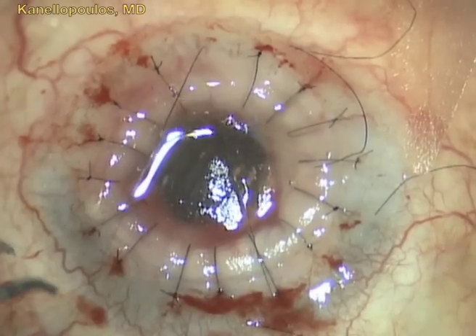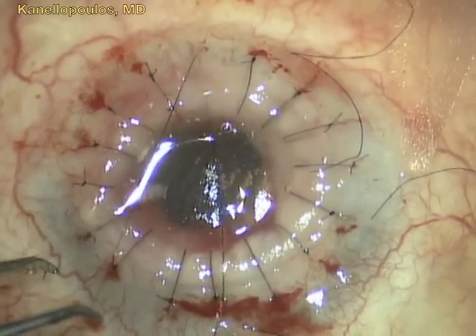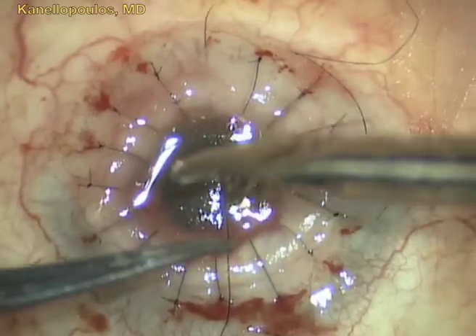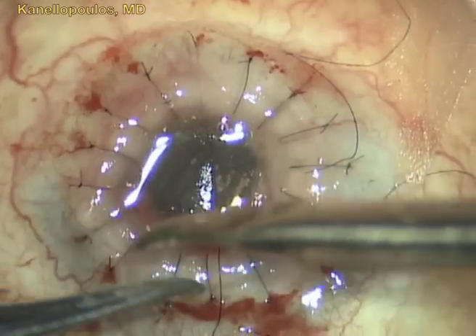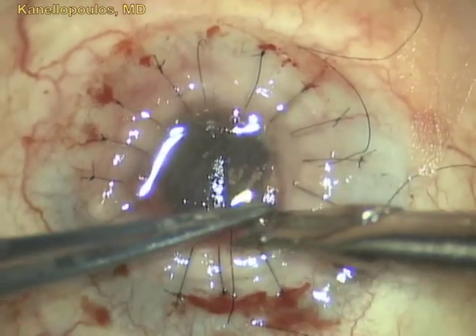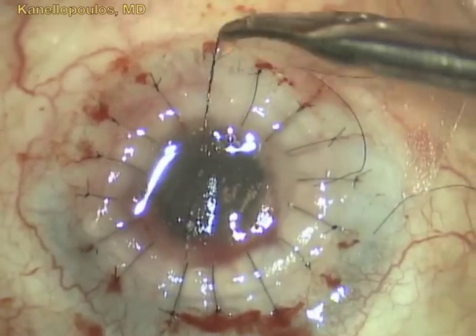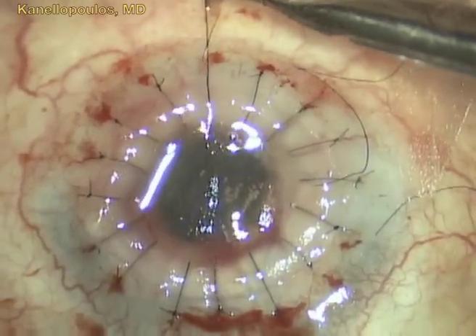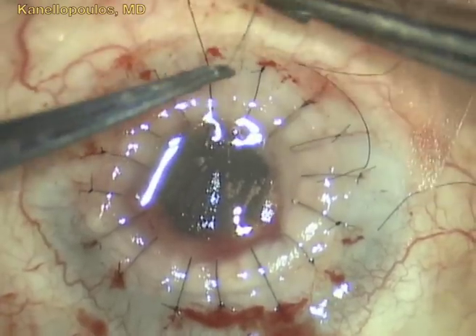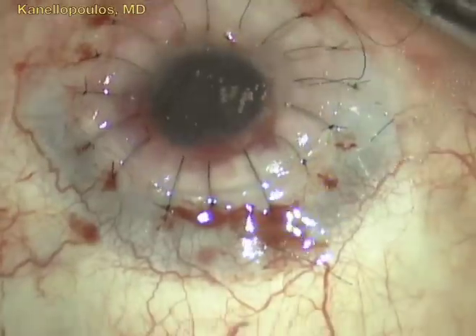Knots are not buried yet. And through the procedure, we made sure that the actual jagged edge of the zigzag technique fit within the appropriate space created in the host bed. All knots square, as you can see here.